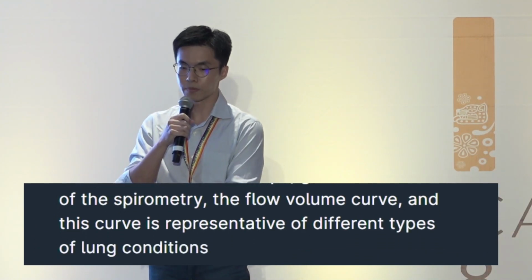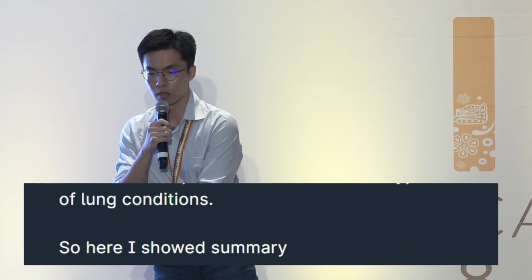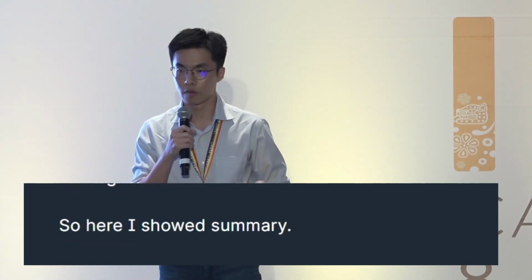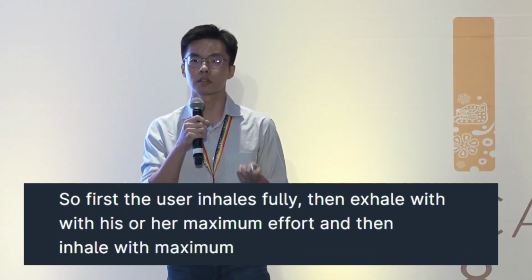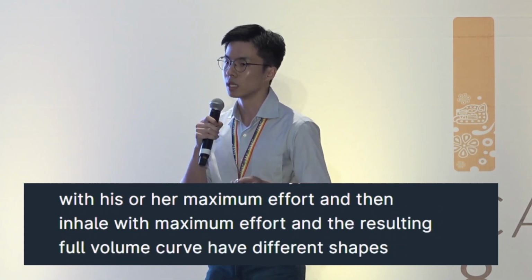So here is a short summary. First, the user inhales fully, then exhales with his or her maximum effort, and then inhales with maximum effort. And the resulting flow volume curve has different shapes that represent different lung conditions.